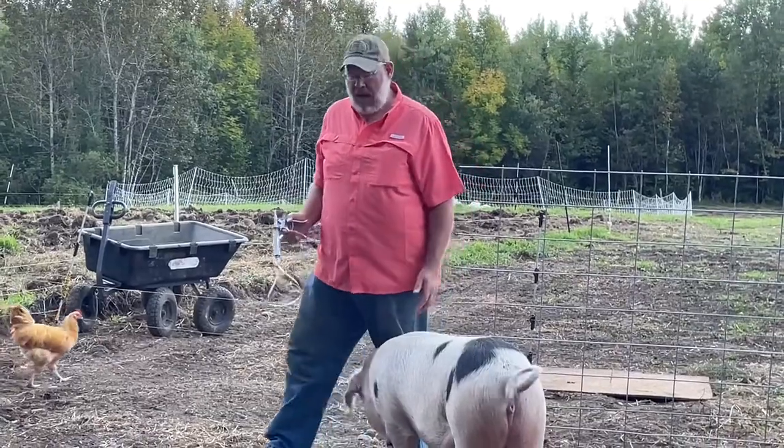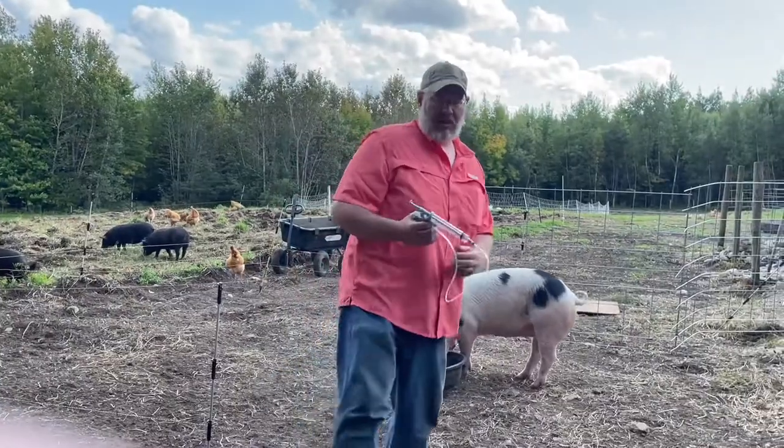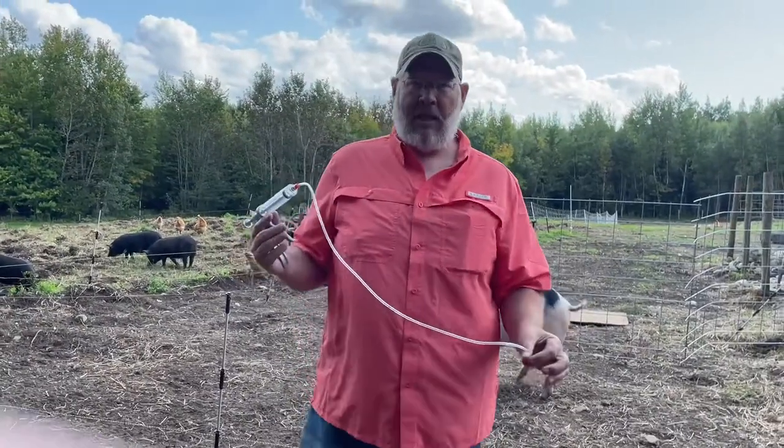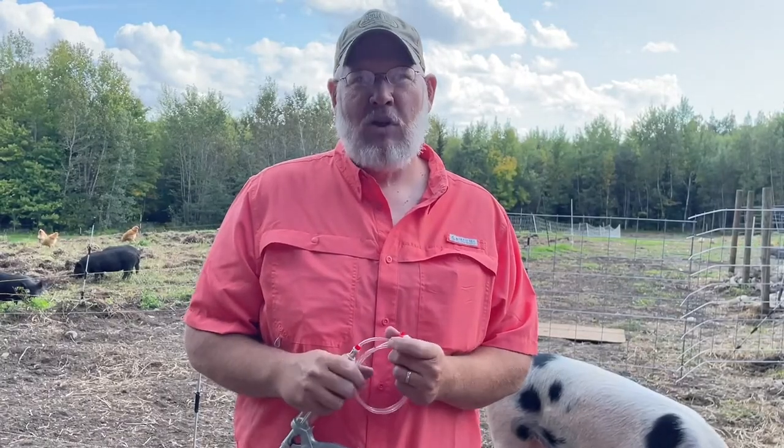They don't like getting shot — the pigs don't like getting shot. However, with a slap shot it makes life a whole lot easier. We recommend that you get the slap shot. You can order it online.